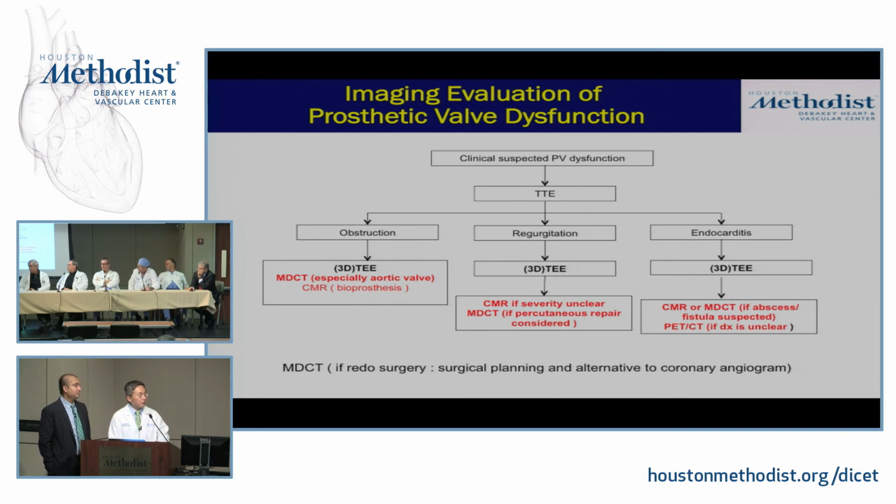Yeah, we've done several cases, and we haven't systematically looked at our experience here. This is all published in the New England Journal of Medicine, and I think the incidence is probably the same between the percutaneous and surgical valve. But again, this is one of the hot topics, and Colin, you can correct me, I think there's some ongoing prospective study looking at this issue.